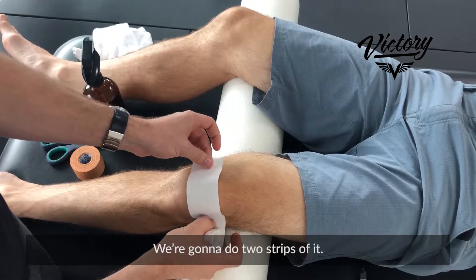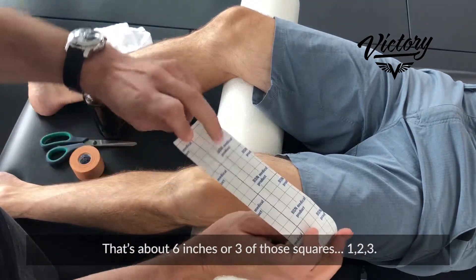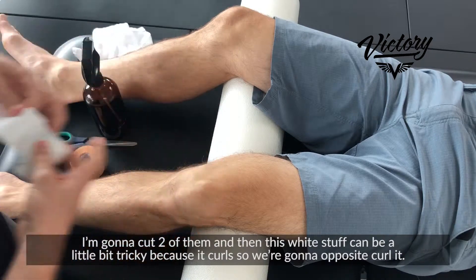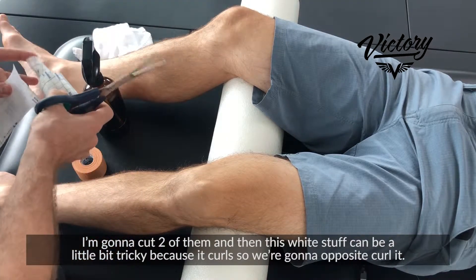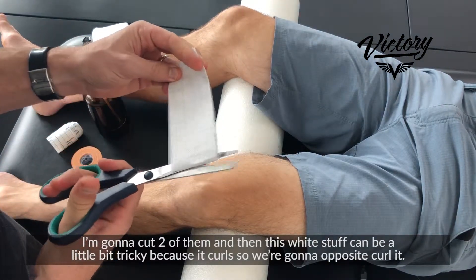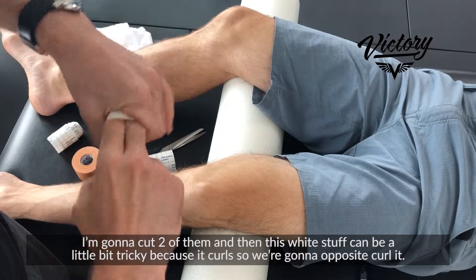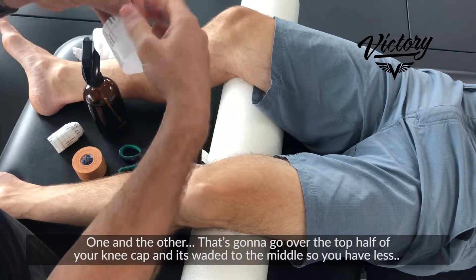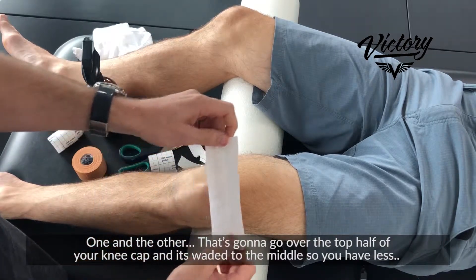The first roll is this white one. We're gonna do two strips of it — about six inches, or three of those squares. One, two, three — so I'm gonna cut two of them. This white stuff can be a little bit tricky because it curls.